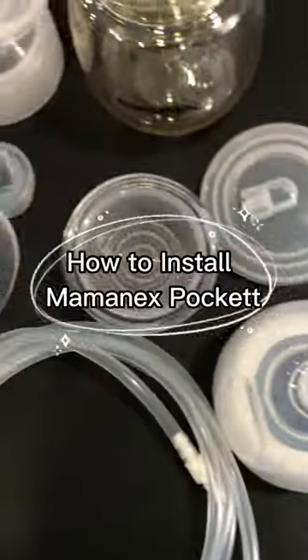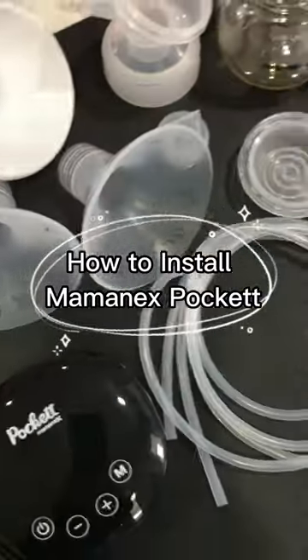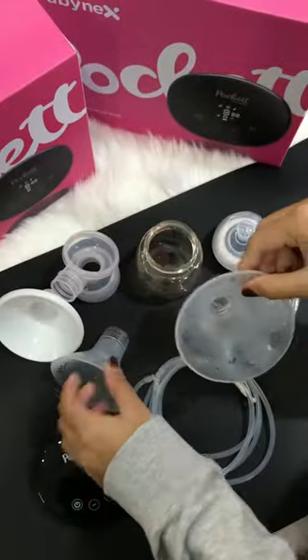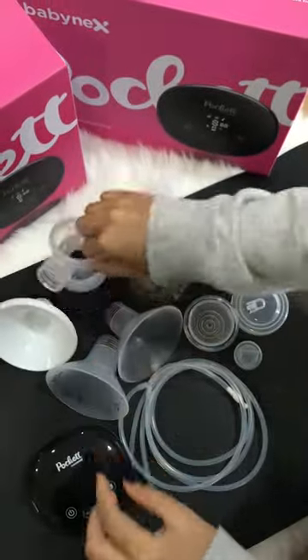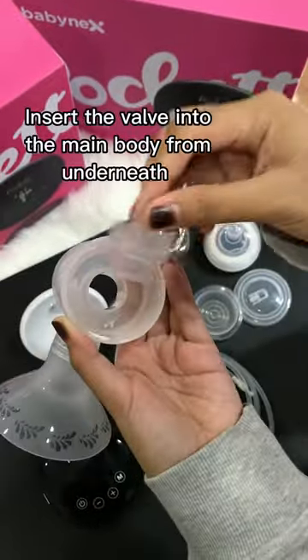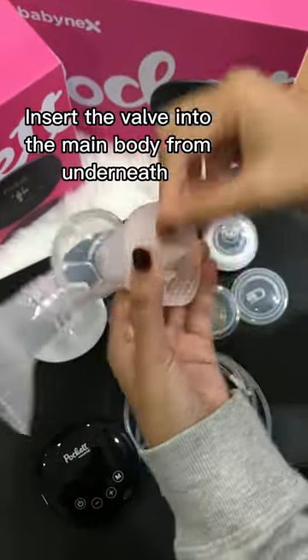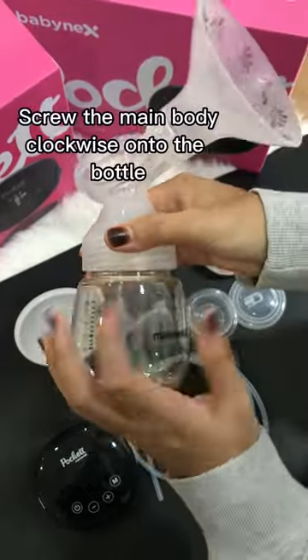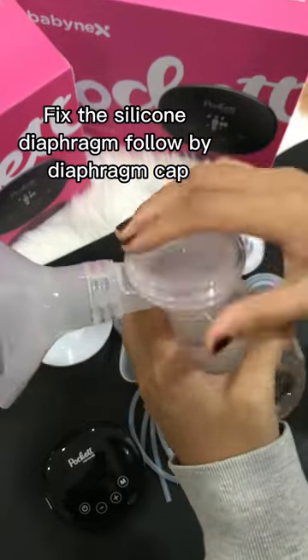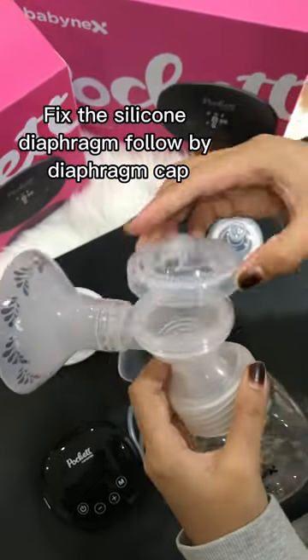How to install the Mominex Pocket: Insert the valve into the main body from underneath. Screw the main body clockwise onto the bottle. Then fix the silicone diaphragm followed by the diaphragm cap.